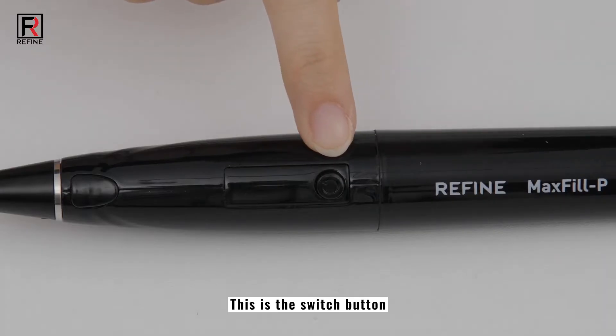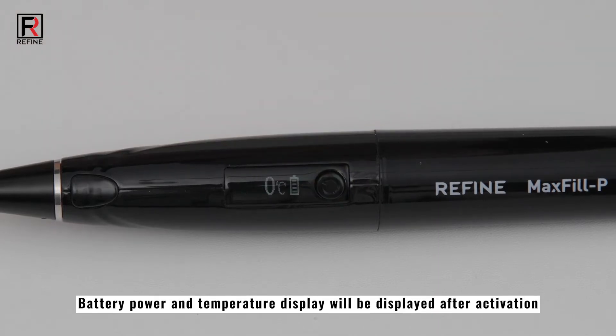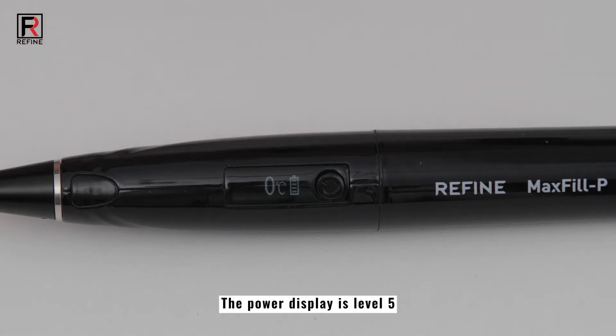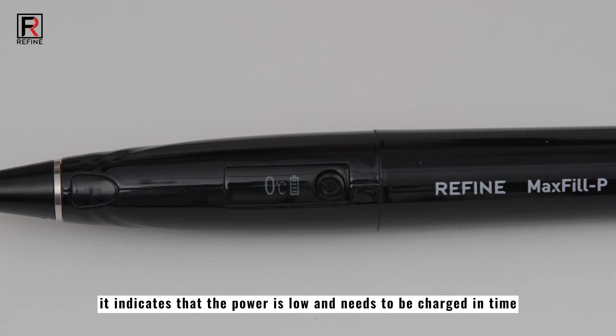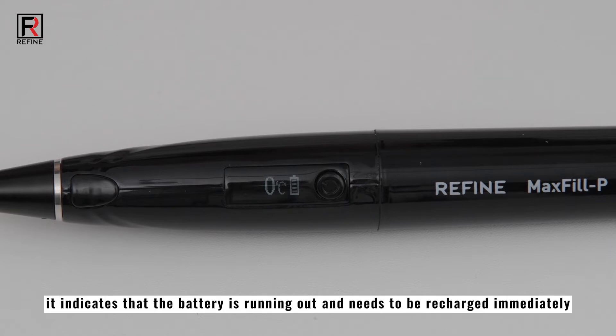This is the switch button. Activate the machine by long press. Battery power and temperature display will be shown after activation. When the battery is fully charged, the power display is level 5. If the power display is level 1, it indicates that the power is low and needs to be charged in time. When it displays level 0, it indicates that the battery is running out and needs to be recharged immediately.